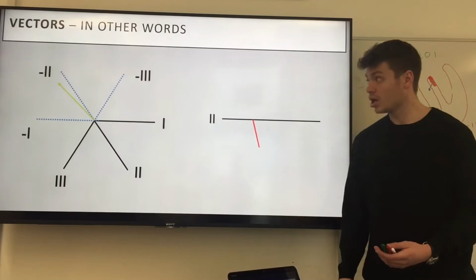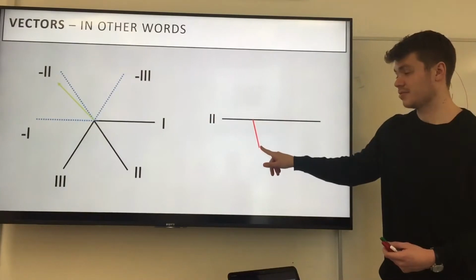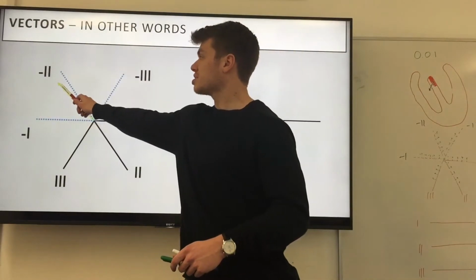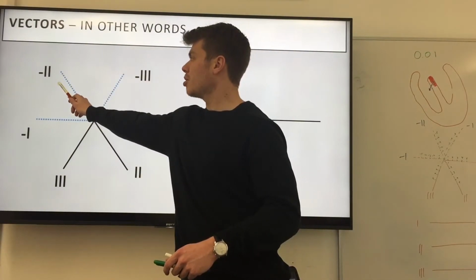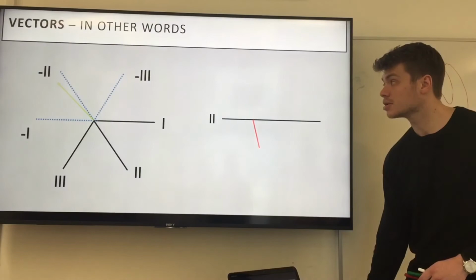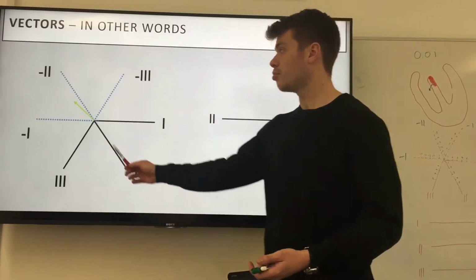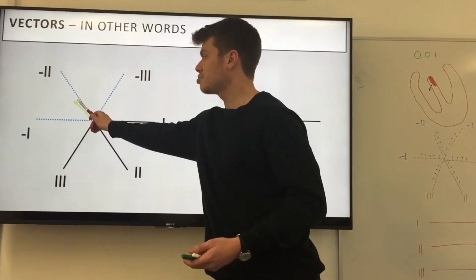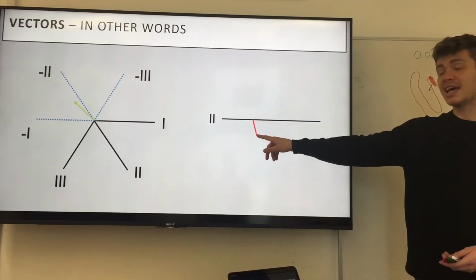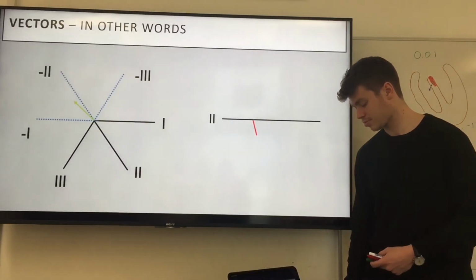a downstroke. And the size of this arrow that we can see here is proportional to the length of this line here. So we can see that the point where this arrow crosses lead 2 will be a line that's perpendicular to it. It's about here. Whereas if we look at this next slide here, the arrow is slightly smaller. It's still negative, but it crosses the line at this point rather than this point, which means there is still a negative line here, but it's just not as big as it was before.